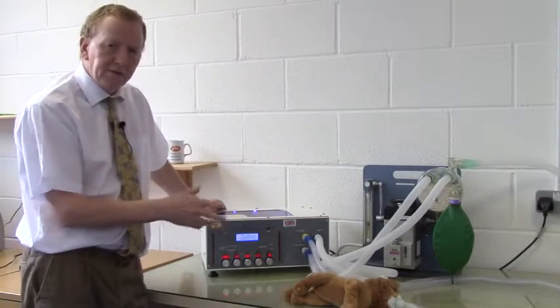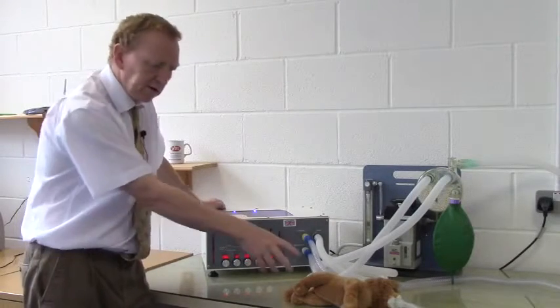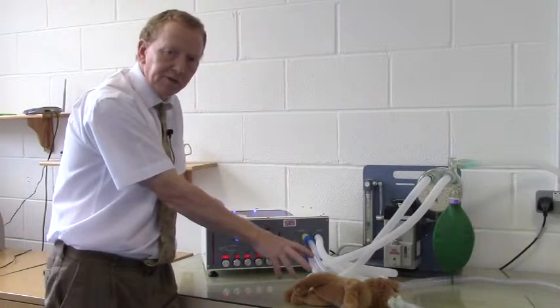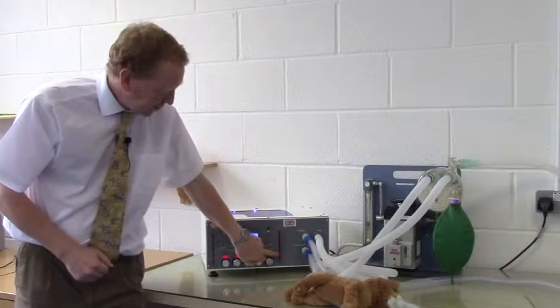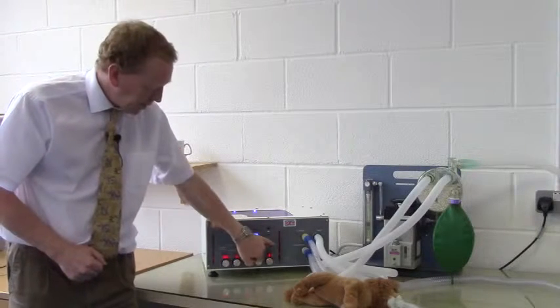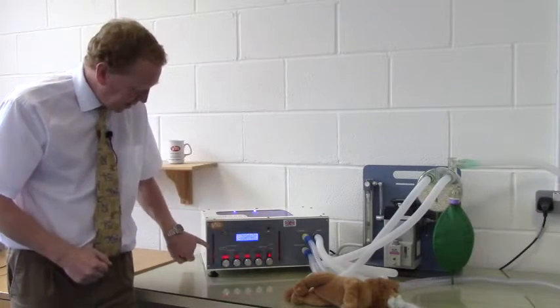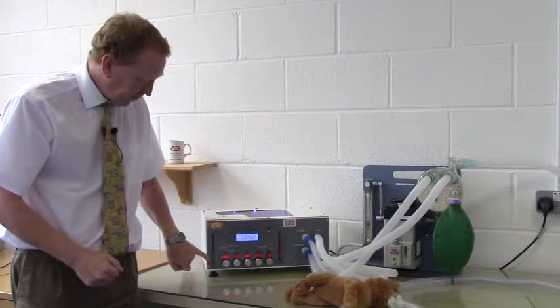Now the ventilator is delivering 200 mils in 1 second, and you'll see Leo's chest rising during the inspiratory phase. You'll also see here the airway pressure in the inspiratory circuit and the expiratory circuit rising and falling with the inspiratory phase.